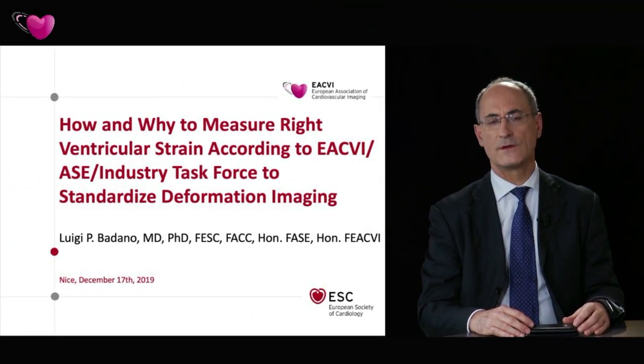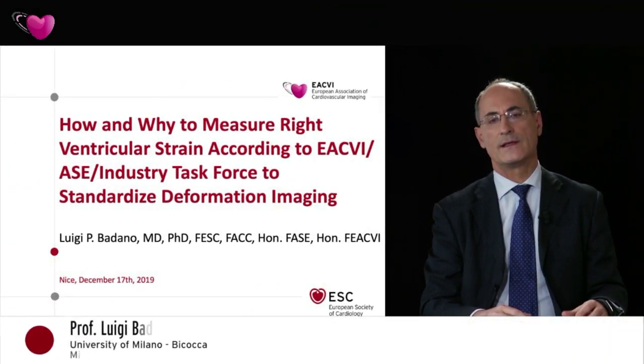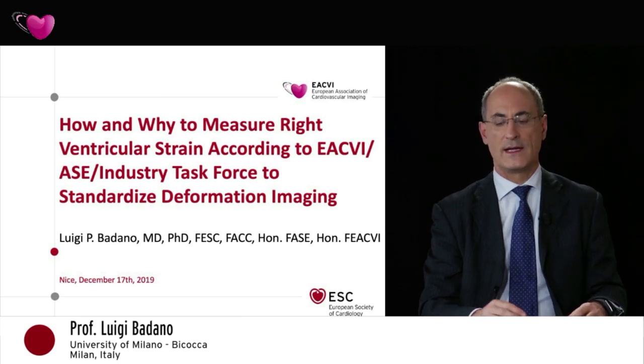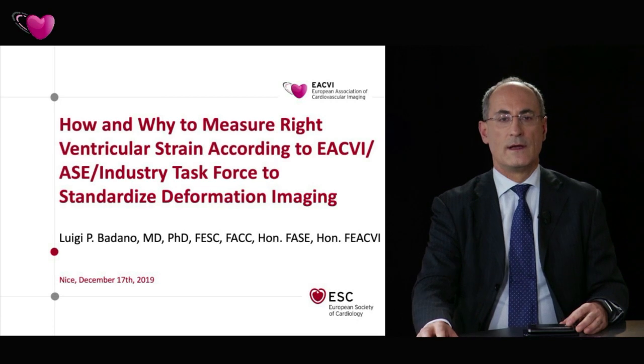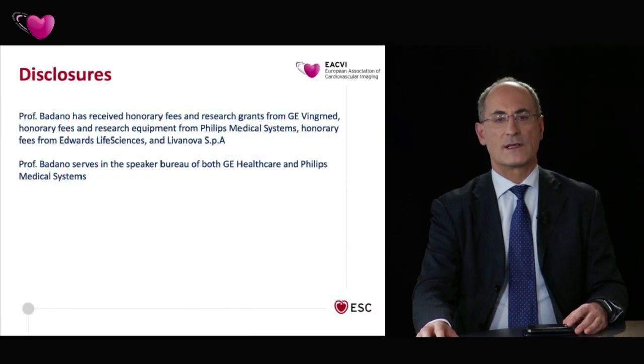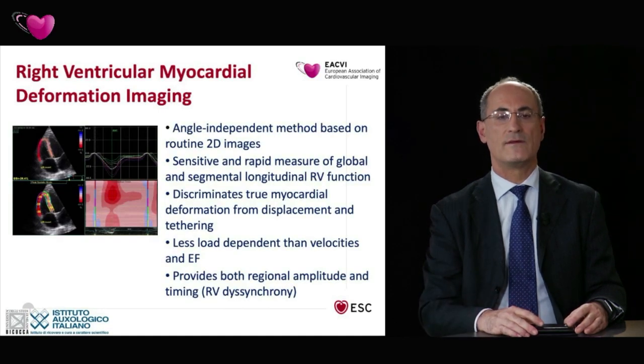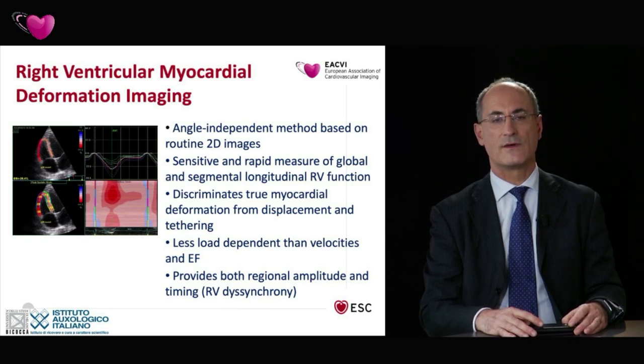In the next 20 minutes, I would like to share with you some ideas about why we have to implement right ventricular strain in the routine of the echo lab and how to do that. My first slide is about my disclosures that are listed here, and then I would like to start with a summary of the pros about right ventricular myocardial deformation imaging and right ventricular myocardial strain.